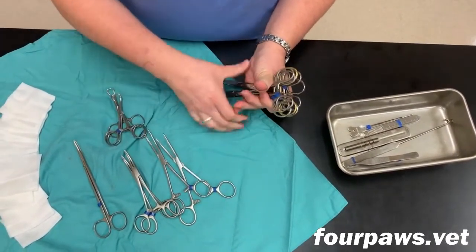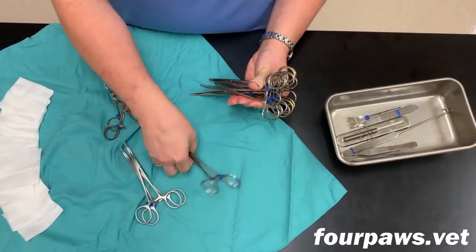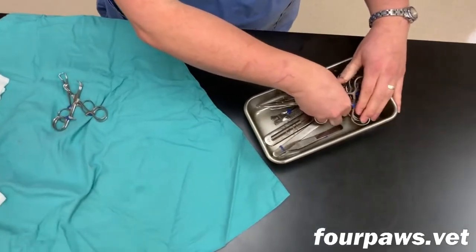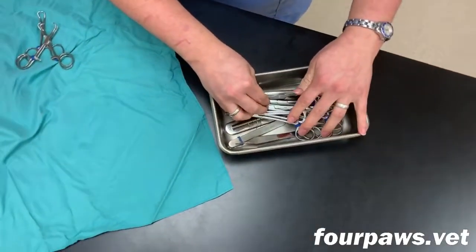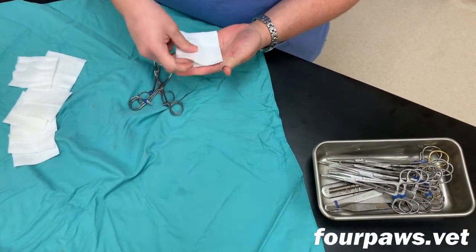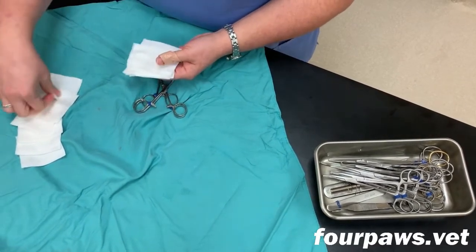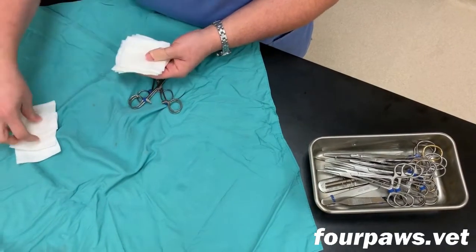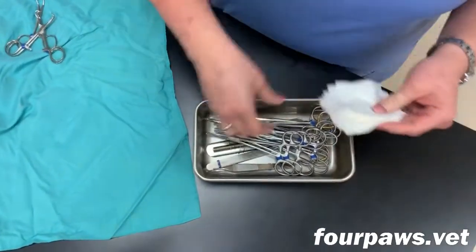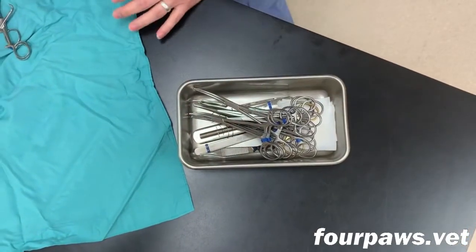Once you have collected all the appropriate instruments, they can be transferred into the metal tray. The instruments are loaded in a particular fashion every time so that they're in the same order every time when you unwrap the pack. It is also important that the assistant who is preparing the pack count out an exact number of gauze sponges to place in there, so that we know exactly how many are in there to assure that none are accidentally left behind when the surgery is completed.